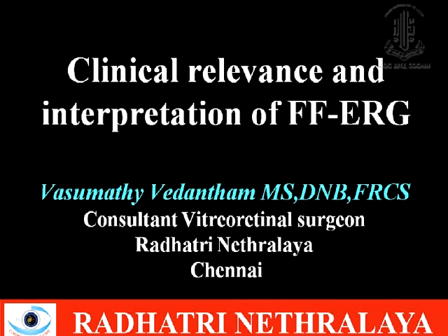So my talk would be on clinical relevance and interpretation of full field ERG, and I'll basically be showing you clinical examples. Please stop me if you have any doubts in between. I don't have any financial interest.